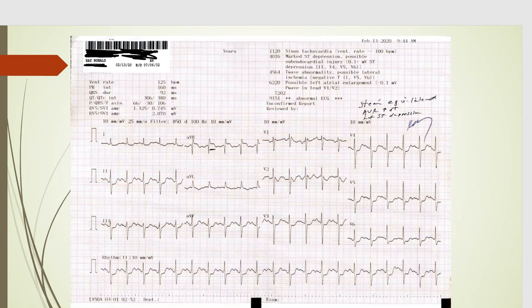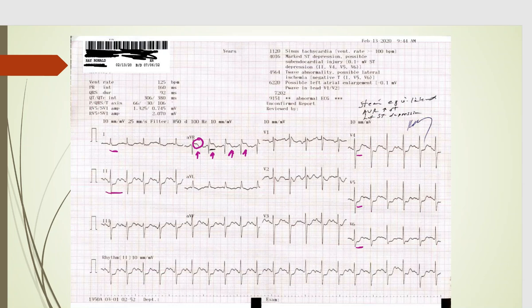Here is the EKG — I marked it up a little in the ER. You can see in AVR the ST elevation; they say it should be more than a millimeter, but this is quite a bit more. You can see the elevation here, along with reciprocal depression most pronounced in the lateral leads V4, V5, V6, as well as lead one and lead two. The computer read was way off, which they usually are — that's why I don't pay much attention to what the computer says.